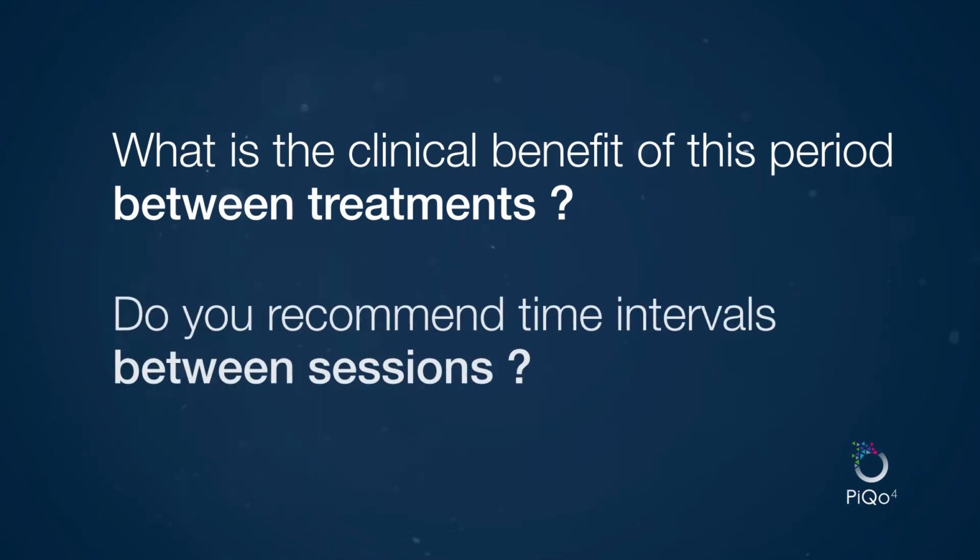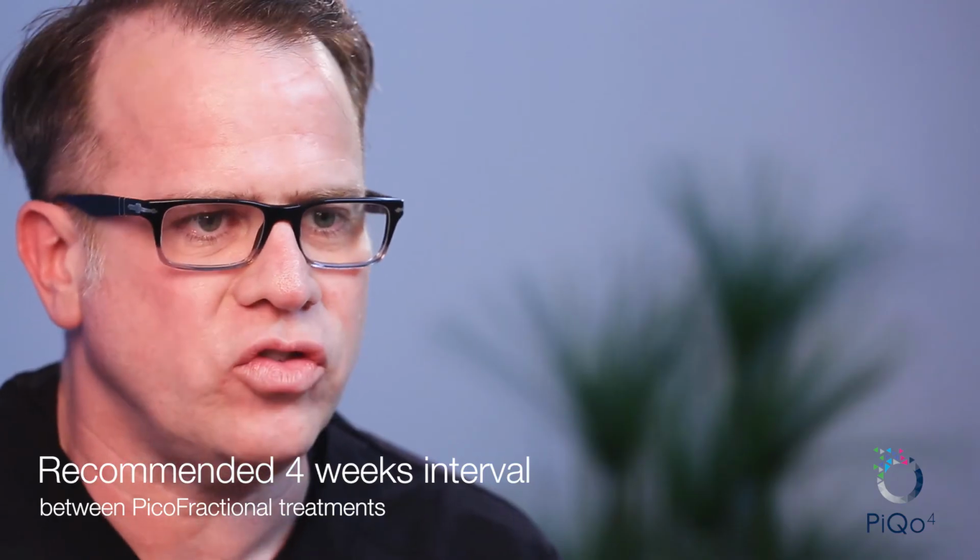We get very favorable feedback on the treatment with the PicoFractional. One of the main things is that there's very little downtime, so people are able to go back and live their regular life without having to stay out of the limelight, out of the sun, out of going to work, and so forth. We found that 4 weeks is an appropriate amount of time. That starts the collagen renewal process and gets it into full swing, with regular maintenance treatments after that.